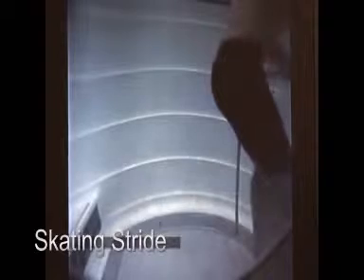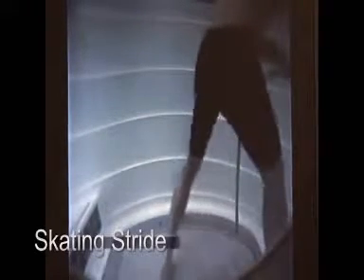Work both directions. Facing forward, the extension with opening up your hip, and again, this might be a little bit more specific to hockey. Working on the range of motion, you're doing extension and then externally rotating the hip. Very similar to the hockey stride, but there again, that can be transferred over to any type of sport. As far as if you're doing a 45-degree cut, that's kind of what you're doing to your hips.